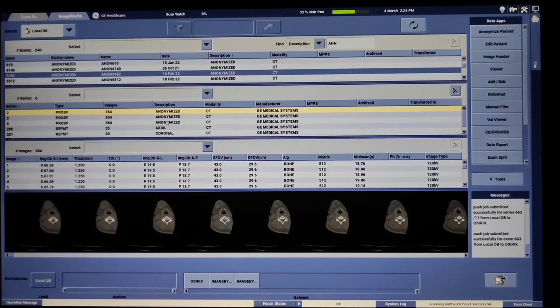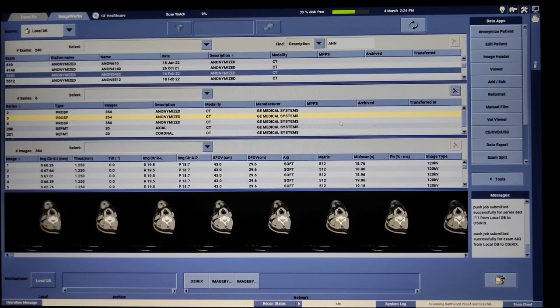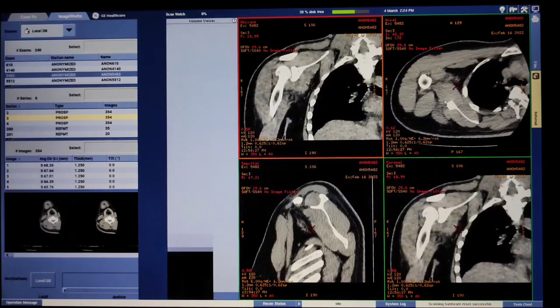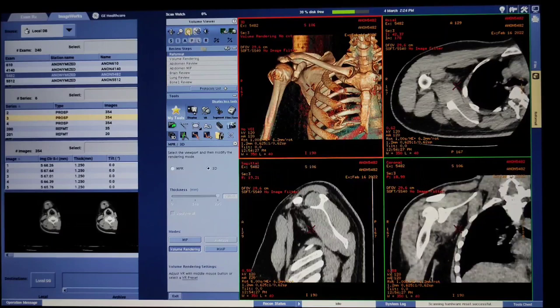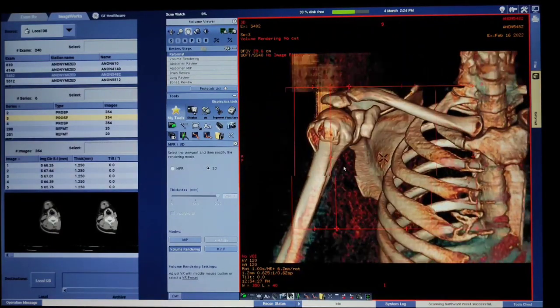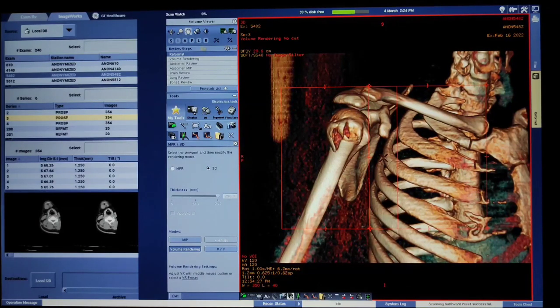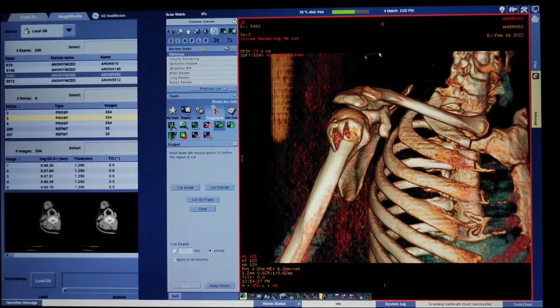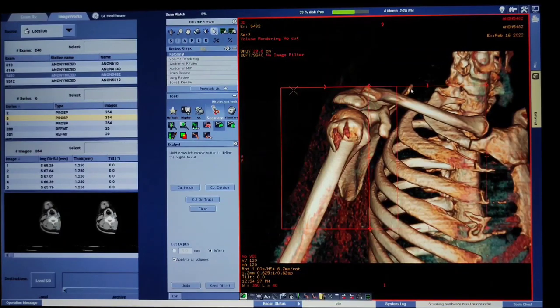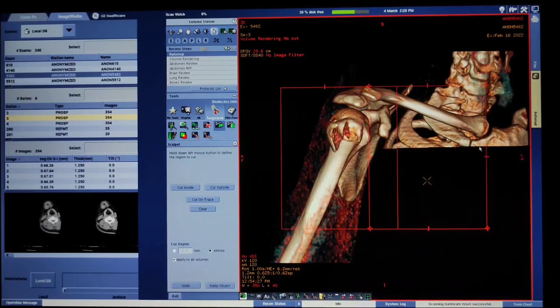Now we have to make 3D images. We have to use Soft Thin and Reformat it. After loading this oblique, we have to select the oblique and convert it. We have to select the pane and double-click it in a single window. Then we have to select the shoulder cutting — covering the clavicle, scapula, and humerus. We have to select the rib cage for removal, then select the segment, then select the scissor to define the outside and inside region.